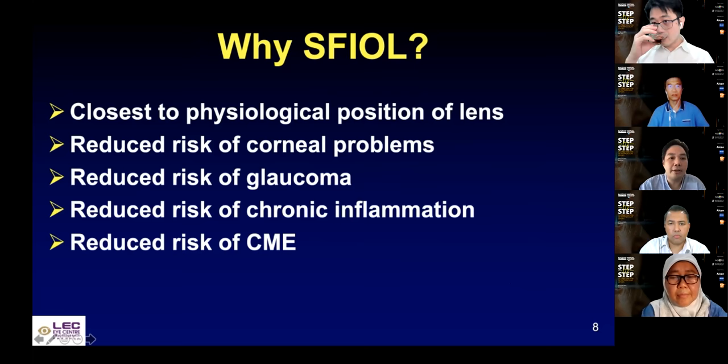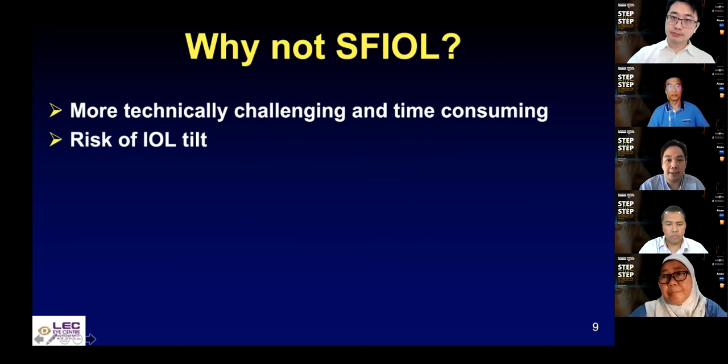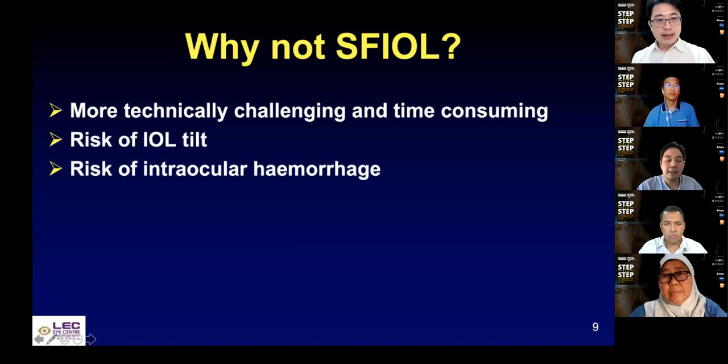So why not? I think it is technically challenging. It is not for the faint-hearted. There's quite a bit of acrobatics you may have to do, especially if you're handling sutures and scleral fixating with sutures. It can be time-consuming, so you have to give time to do these cases, and as a surgeon yourself, you know whether you want to invest the time to actually try and do these cases.